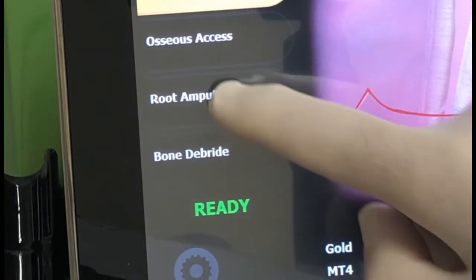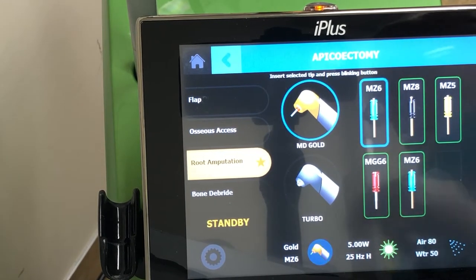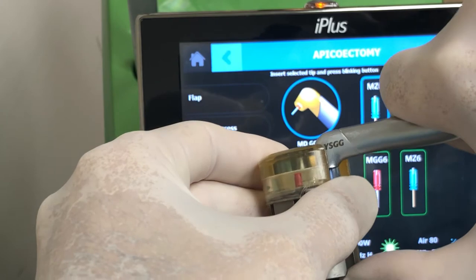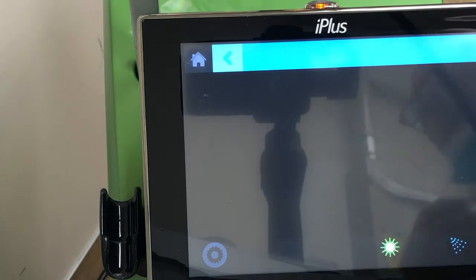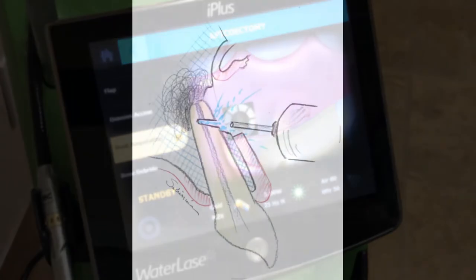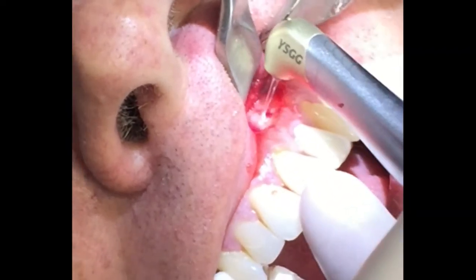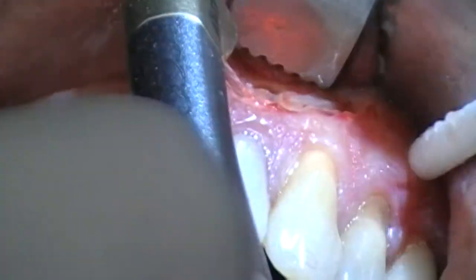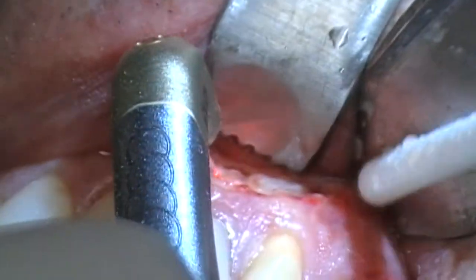At this point we are setting up the laser for the hard tissue or root amputation setting, which involves higher power and a different tip. Based on our CBCT length studies, we use a periaprobe from the incisal tip to establish the exact entry point for our apicectomy. The laser setting is the same for the bone window as well as the root, so we do not have to make adjustments there.